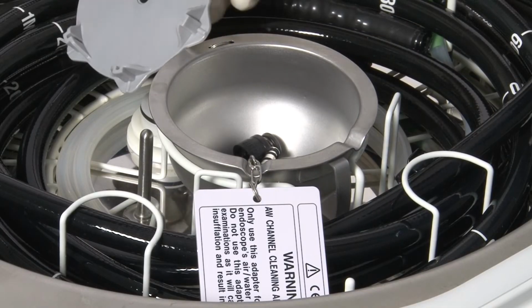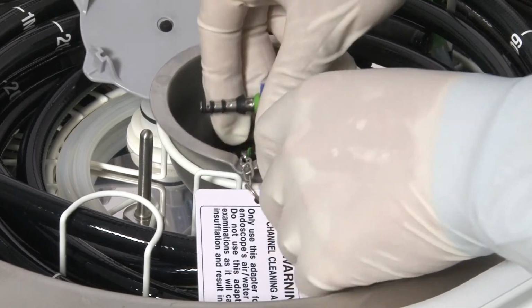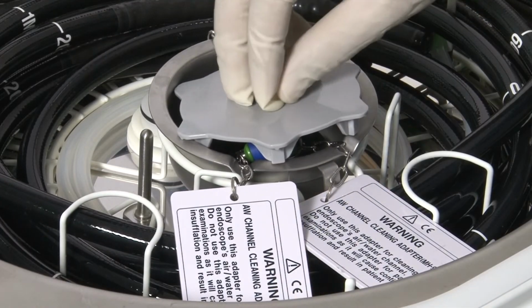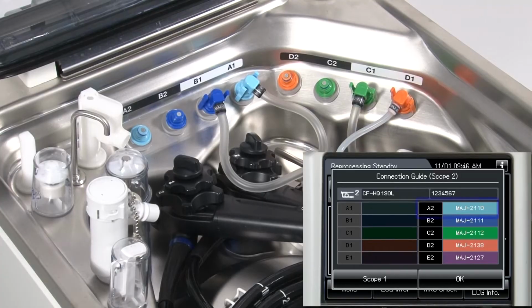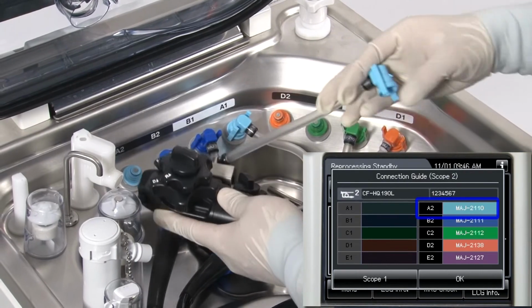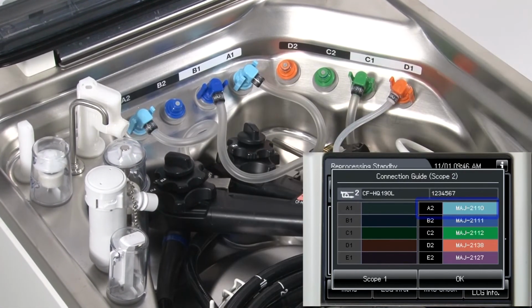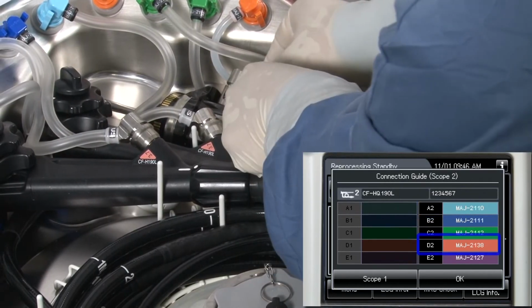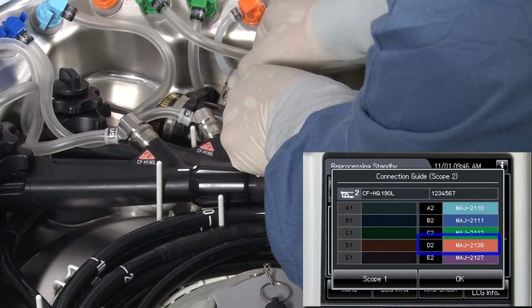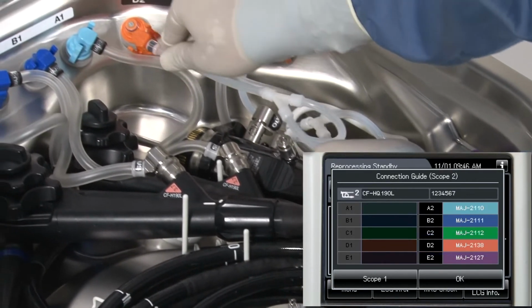Please put the accessories in the washing case in the same way as for the first endoscope. Please connect the connecting tubes to the second scope and the OER ELITE in the same way as for the first endoscope. Please connect MAJ2138 to the second endoscope and the OER ELITE in the same way as for the first endoscope.